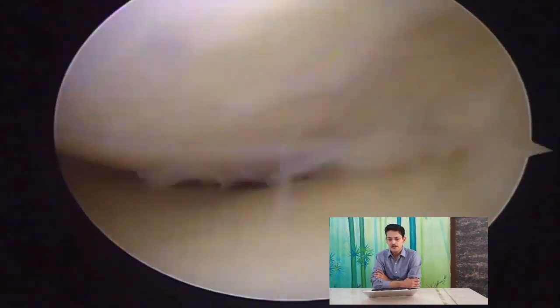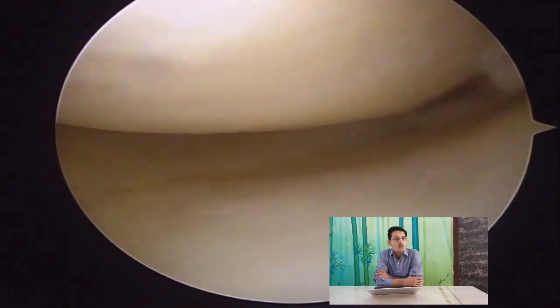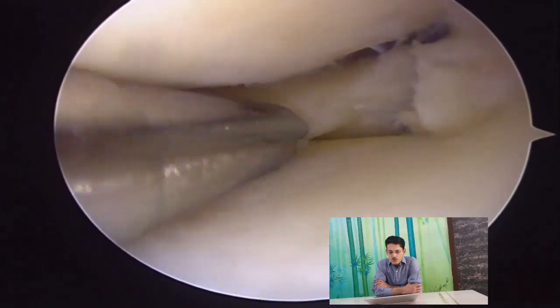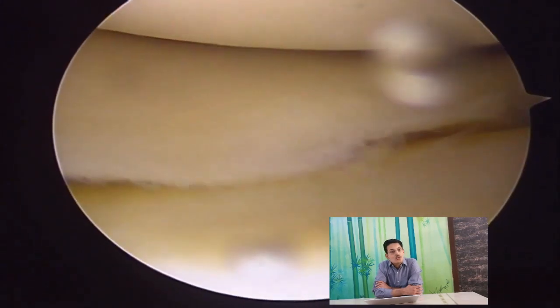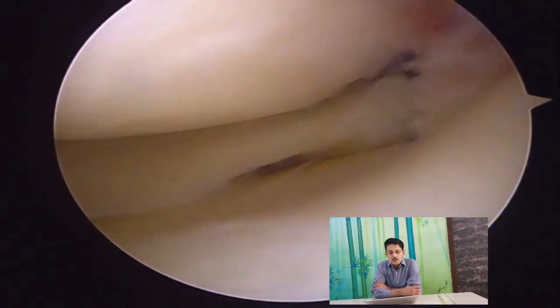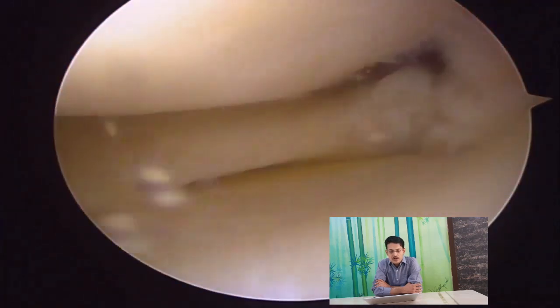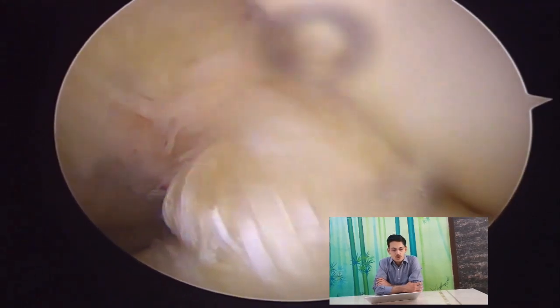Now we see another patient — she is 40 years of age with a little bit of mucoid degeneration in the ACL. There is a tight medial joint space, and a little bit of pie-crusting is needed to reach the posterior corner of the knee. In the initial view we will not see a good tear, but when we use the shaver as a probe, we can see a significant radial tear on the posterior-most aspect of the root, which is equivalent to a total meniscectomy because it causes loss of hoop stresses. These tears are bad because they progress into arthritis very fast.